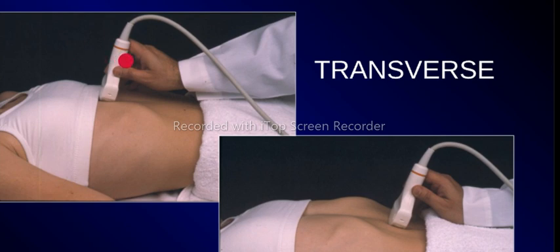at each level. Now, the point of all of this is that even when you just acquire an image, you can be able to tell whether it was taken from the upper part of the abdomen or lower part. That's one. The second thing is when you're localizing masses, you want to be sure if your mass is, let's say, for example, in the pancreas.